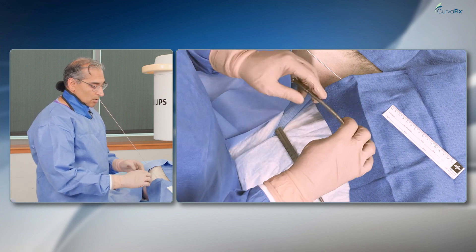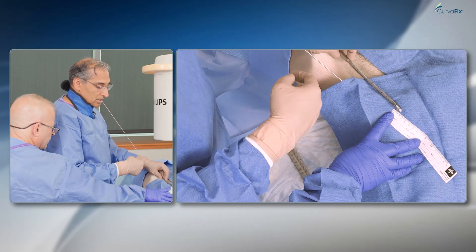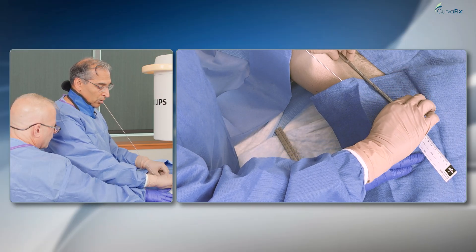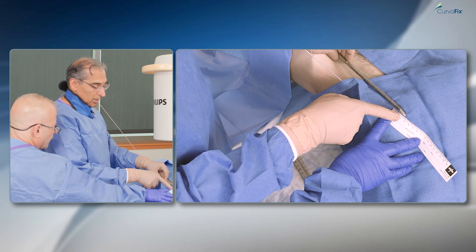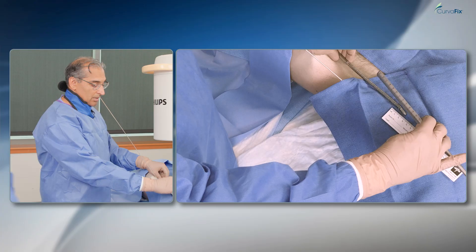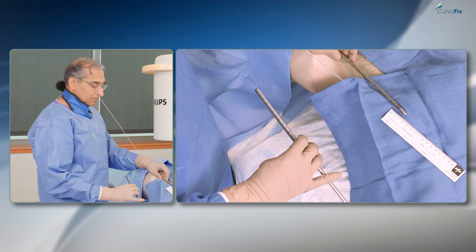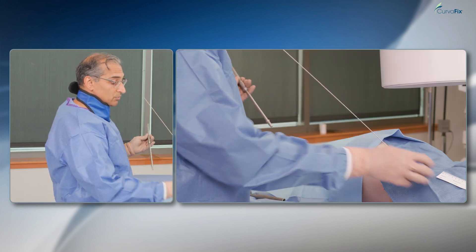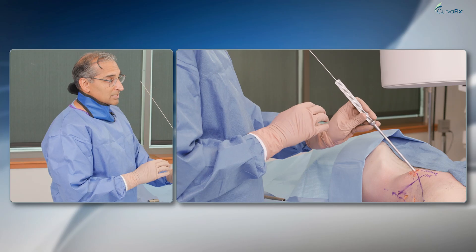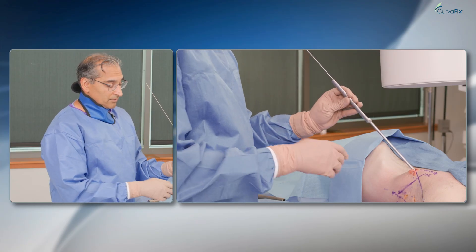You can see a visual demonstration of this. When you look at this ruler, I've stopped the screw at the one centimeter mark. Holding the screw rigid on the proximal body and without moving the ruler, I'll pull on all the links — and you can see it goes from the one millimeter mark to the 2.5 millimeter mark. This screw just lengthened 15 millimeters, consistent with the markings on the measuring guide. So measuring 190 millimeters, I know the screw can get up to 205 millimeters, and I have enough room to accept that.